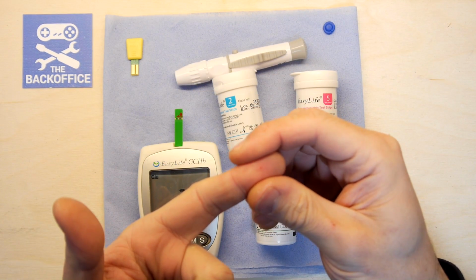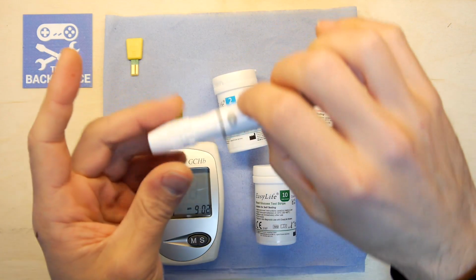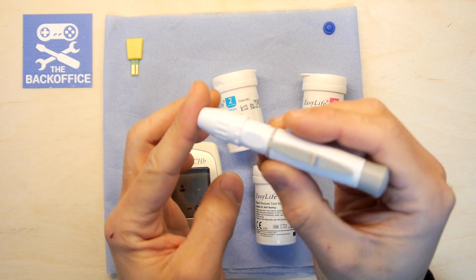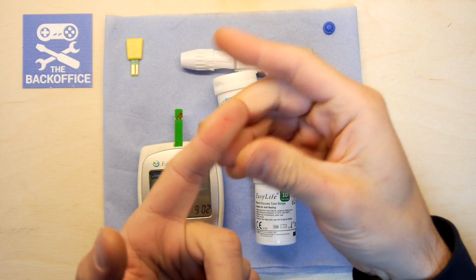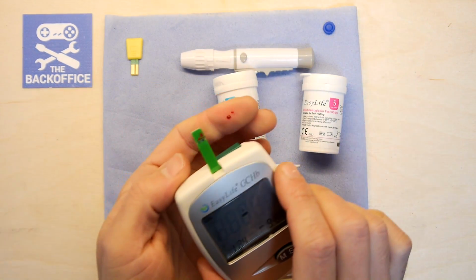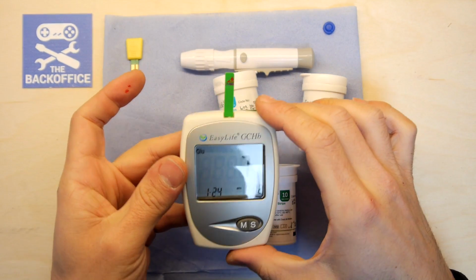Now, it did say don't massage the finger, but look, if I don't massage it, how am I going to test anything? All right, I'll do one more test. I'm going to crank this up to the full whack, pop it out. I'm going to do another one next to it. 3, 2, 1. Deep breath. Yeah, look, guys, I just don't have enough blood in me, so I'm going to have to squeeze that out. I think it's going to be fine. Ready? Let's get it in there. Yep, that got drawn right through to the other side of that strip.